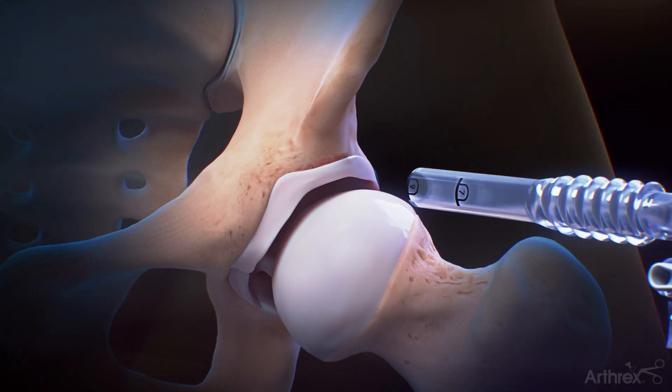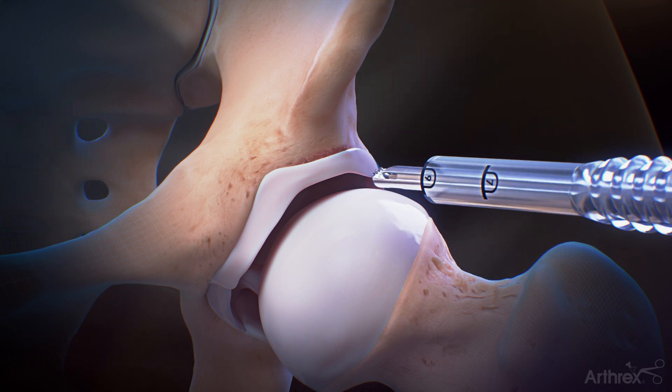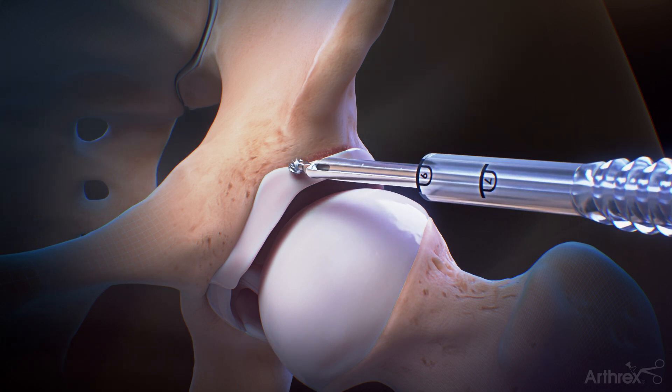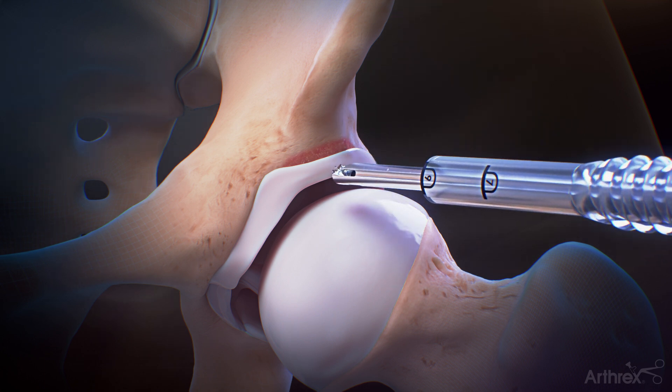Hip labral repair with 2.4 mm knotless hip suture tack anchors and swift stitch suture passers, simple stitch. Insert a 4.0 mm round retractable hood burr through a Tremec custom hip cannula and perform an acetabuloplasty.